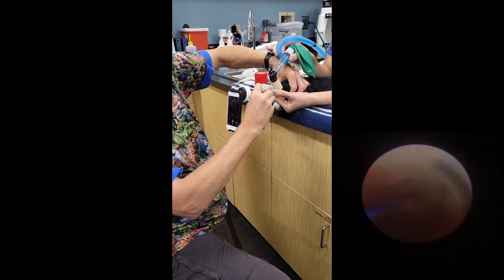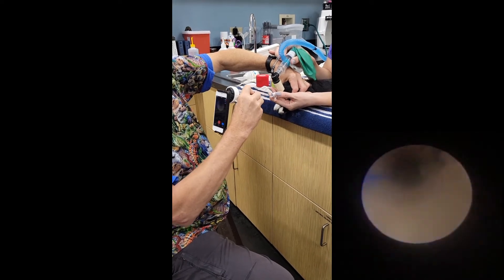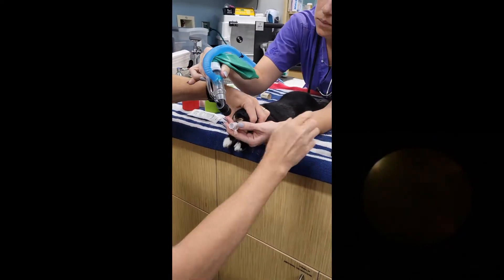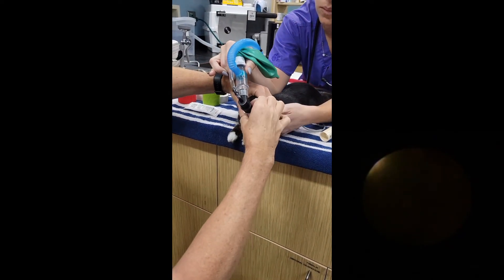My assistant will hold the tube and I'm going to come off. Now we can attach the rabbit to the breathing system.